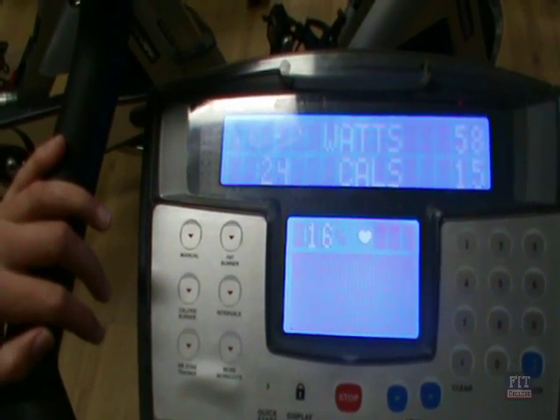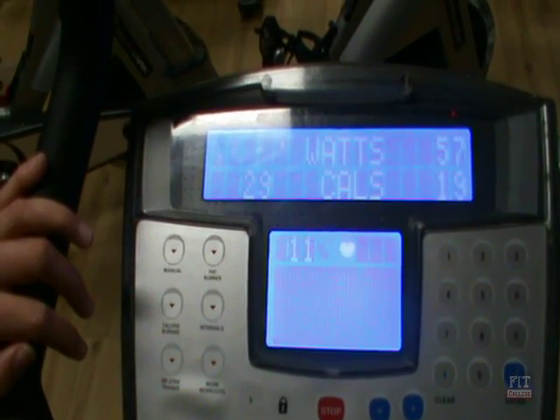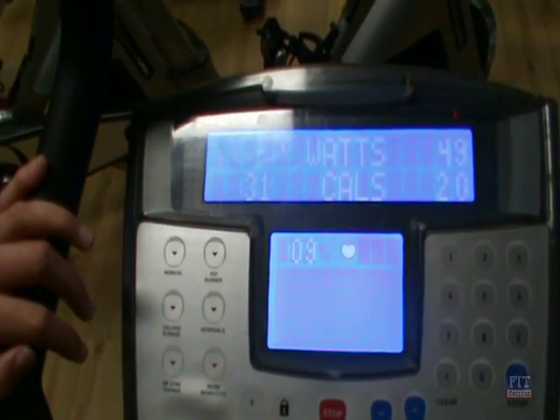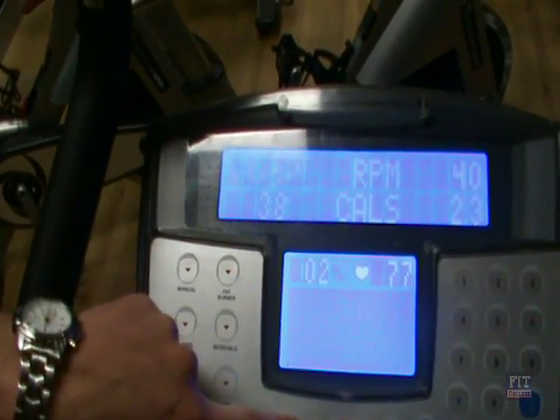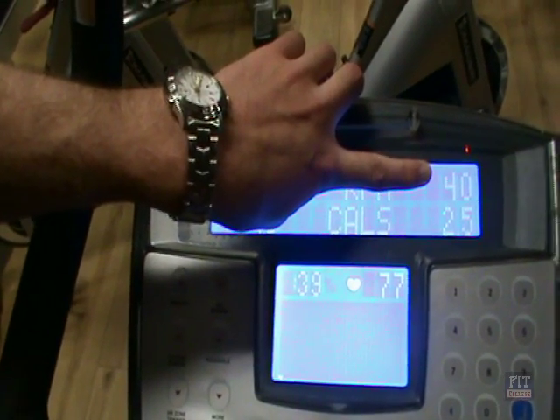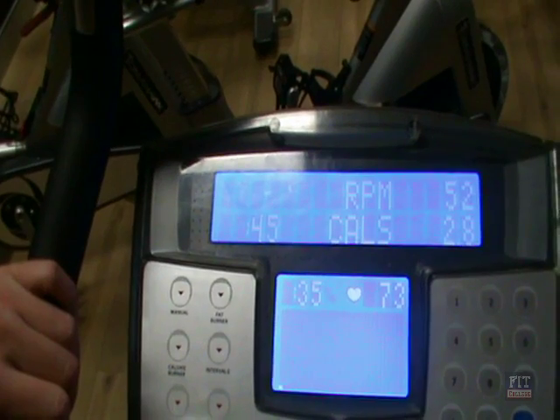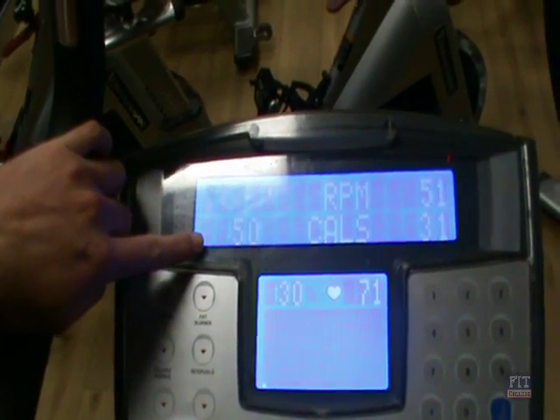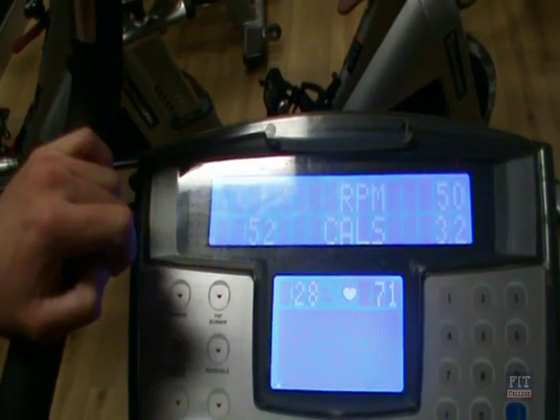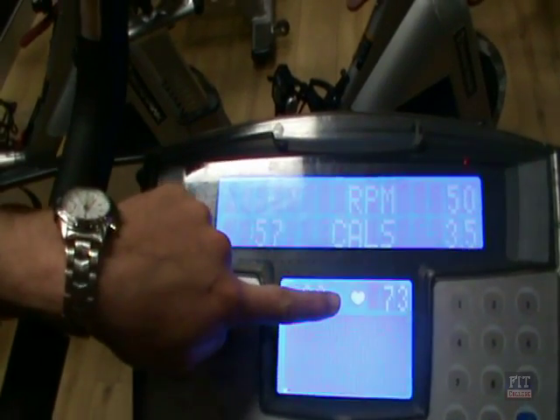Once our client is set up we can use our display and have them continually pedal at 50 RPM. While our client is doing this we are monitoring their heart rate, and you need to make sure that you keep an eye on time. As you can see here we are identifying RPM and the client has brought it up to 50. We will now look at the time as it is coming up to a minute, so we have to prepare and be ready to record the heart rate. The heart rate needs to be recorded at every minute.